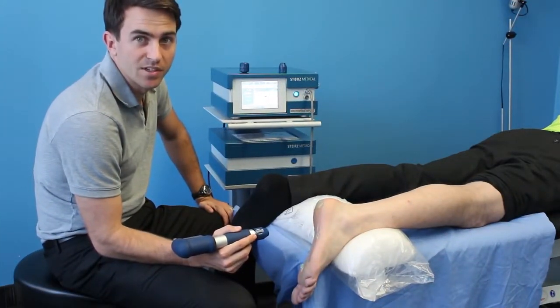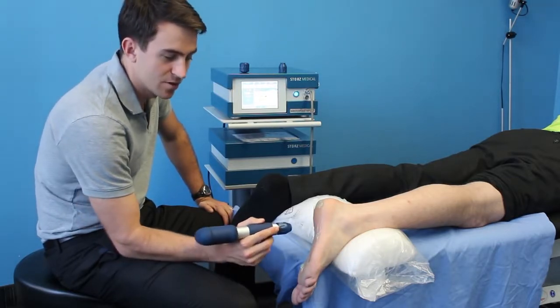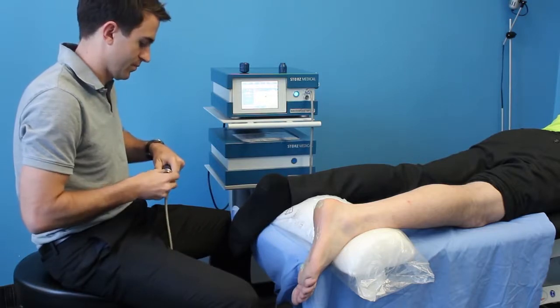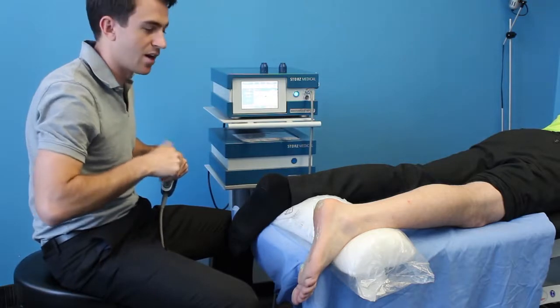The different sized heads available to us here allow us to achieve different penetration and different depth. This means I can use the smaller head for a sensitive area such as the base of the foot, and the larger head when treating the calf.